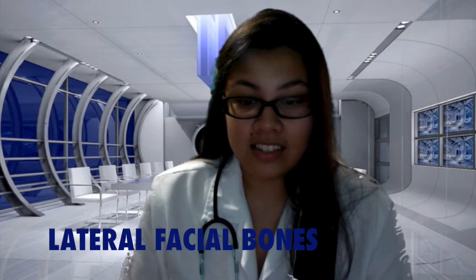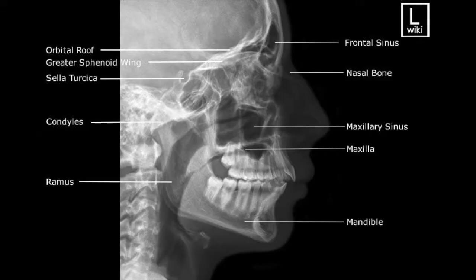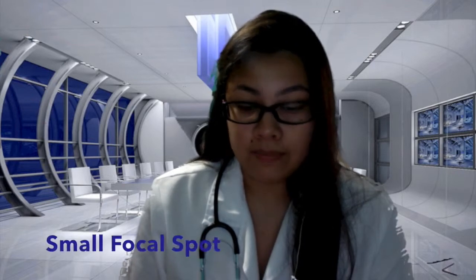In this projection, fractures and neoplastic inflammatory processes of the facial bones, orbits, and mandible are shown. The facial bone routine commonly includes only a single lateral, whereas the skull routine may include bilateral positions. Use an 8x10 IR, 70 to 80 kV range, and a small focal spot. For part positioning, you want the side of interest closest to the IR.